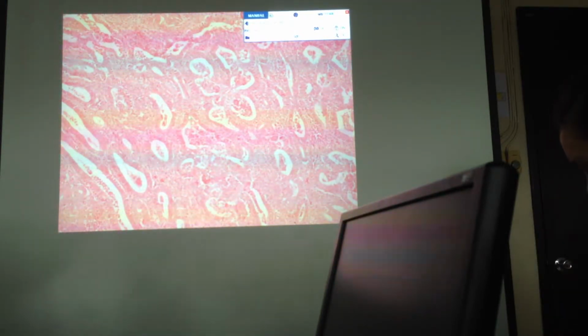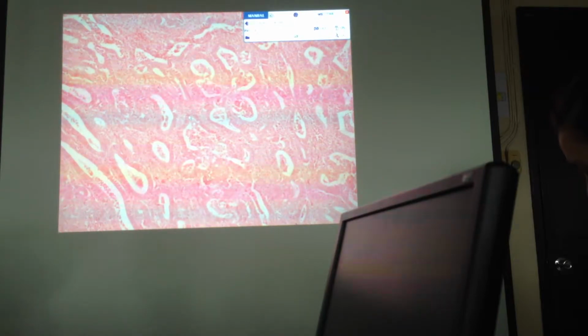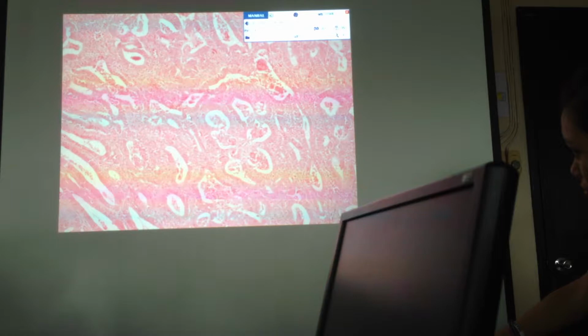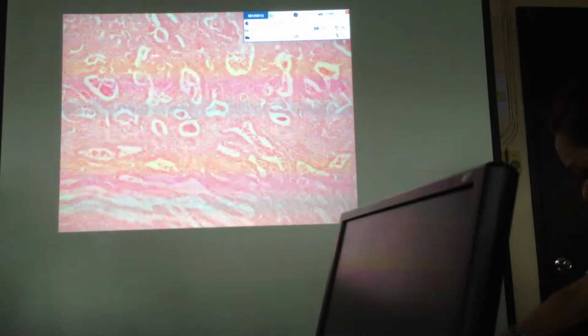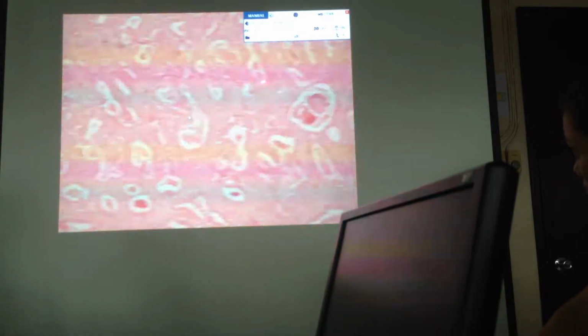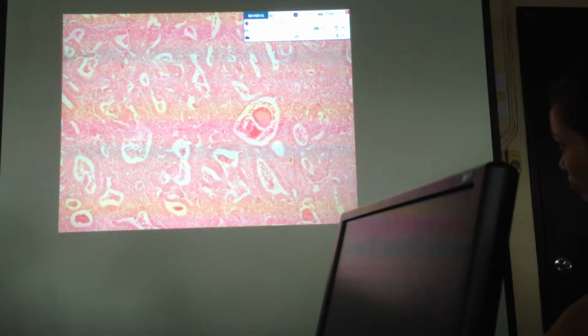Okay, so for endometrioid type, unlike the serous and the mucinous, wherein benign tumors are the most common form, here in the endometrioid, rarely do we see benign forms. It is more common that they are malignant. So this one is endometrioid type. You already know that. Adenocarcinoma, back-to-back configuration.